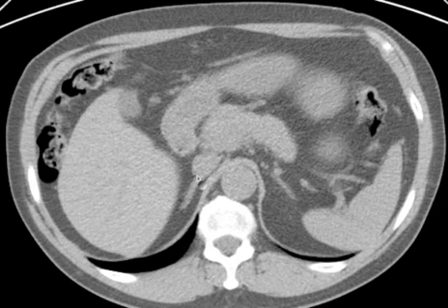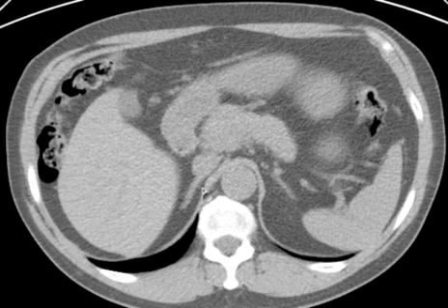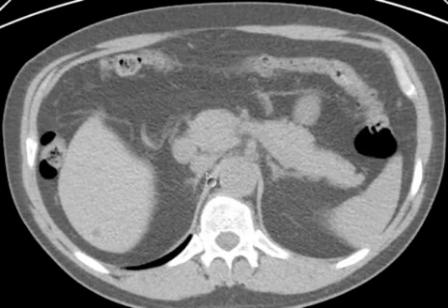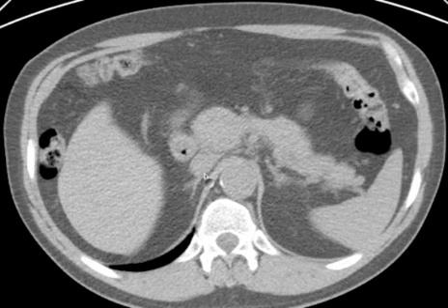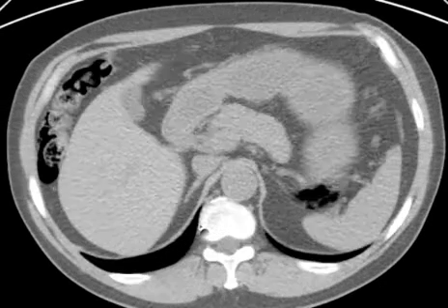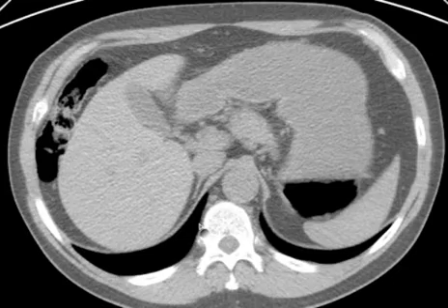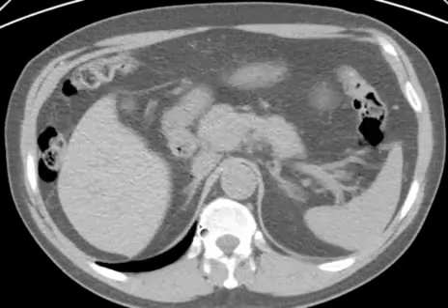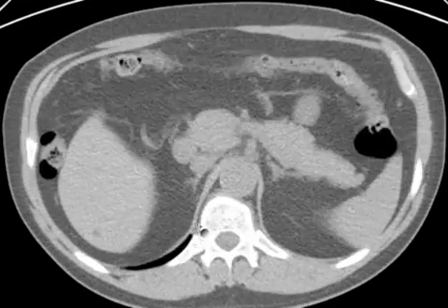So you have to learn to dissociate those from what you're seeing that's adrenal. Here's the adrenal, and there's the IVC. It almost looks like they're joined, but they're just against one another. So here you can see the typical wishbone kind of configuration of the adrenal gland as you go up through it. And so that's adrenal.